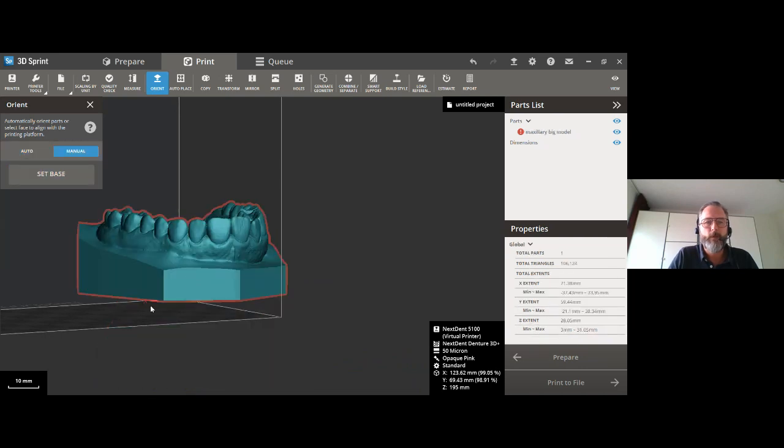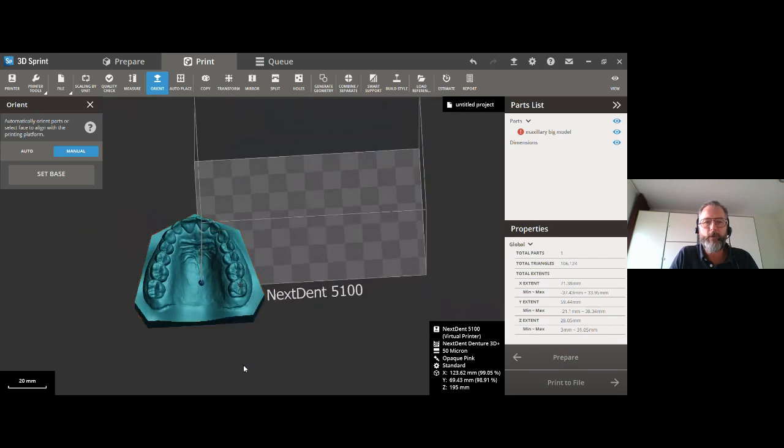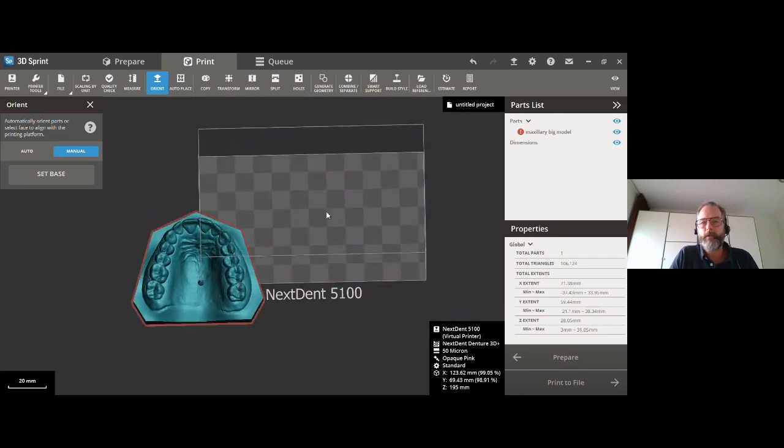A number of models from different software companies already have this. Then having this inside of the platform is slightly more challenging, because we are working on this. For instance, with the new feature that we are releasing, hopefully by the end of this month, coronavirus also has an effect on our schedule, of course, but it's still planned for the end of the month, we will have the auto stacking.